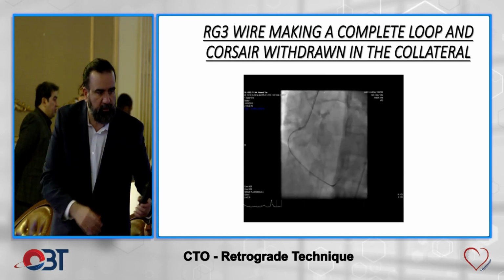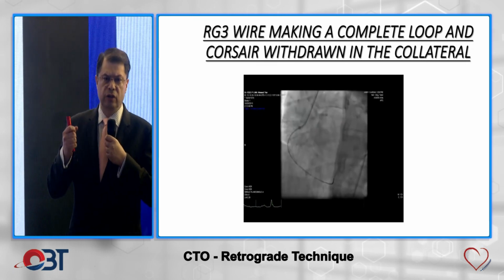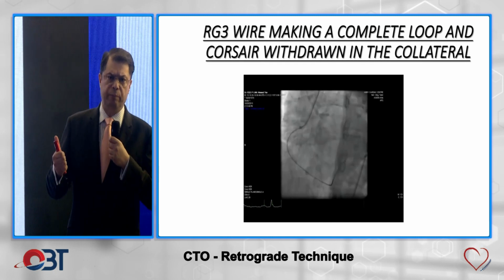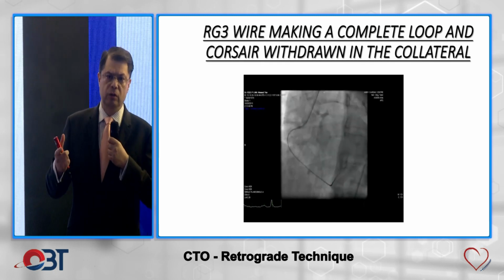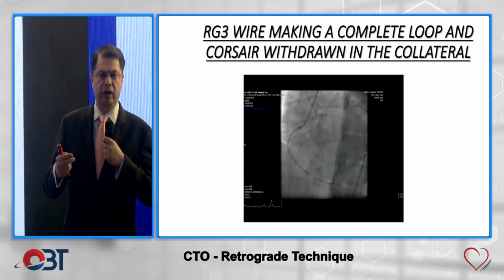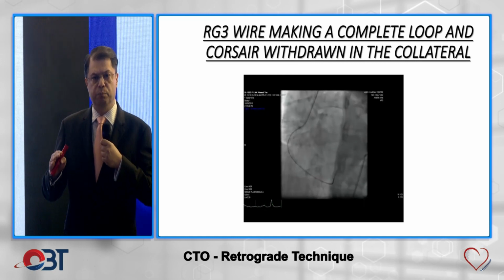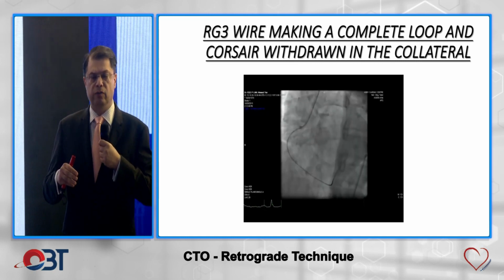Thank you. So this is a very important point Dr. Salman has made. In a CTO case, failure is acceptable, but complications are not. So you have to be as safe as possible and accept failure and learn when to stop rather than pushing hard and creating a complication.